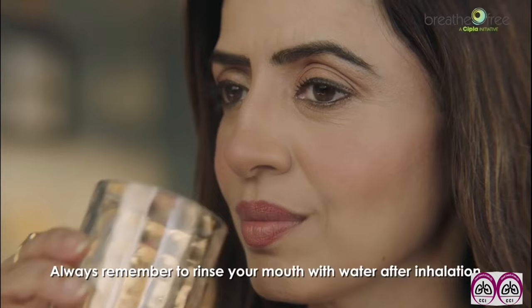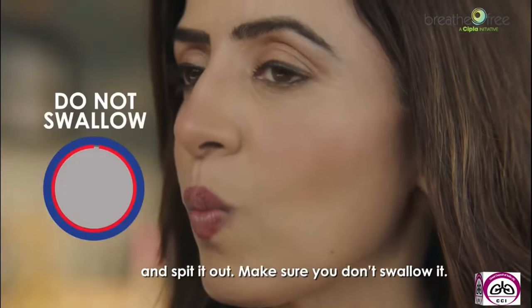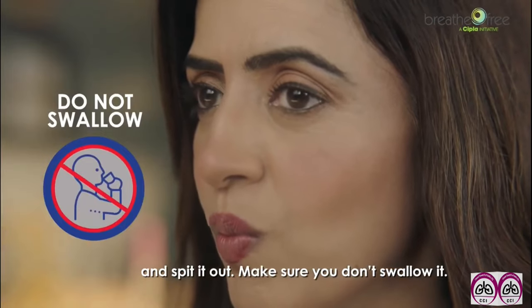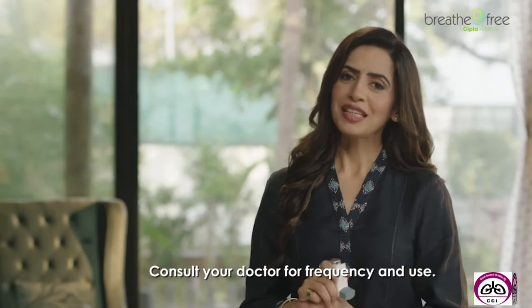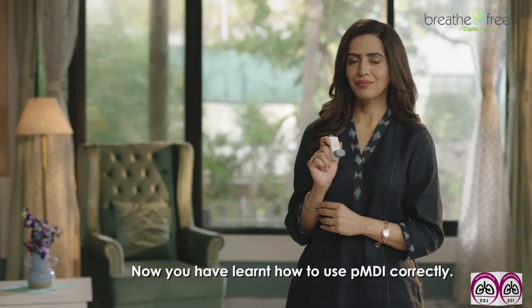Important instructions. Always remember to rinse your mouth with water after inhalation and spit it out. Make sure you don't swallow it. Consult your doctor for frequency and use. Now you have learned how to use this PMDI correctly.